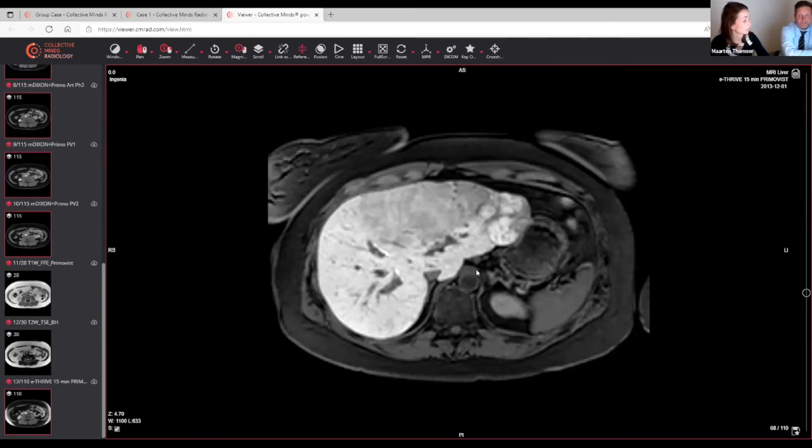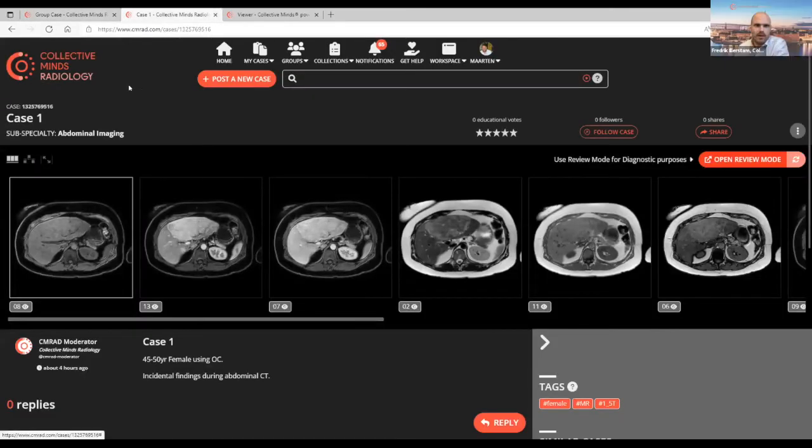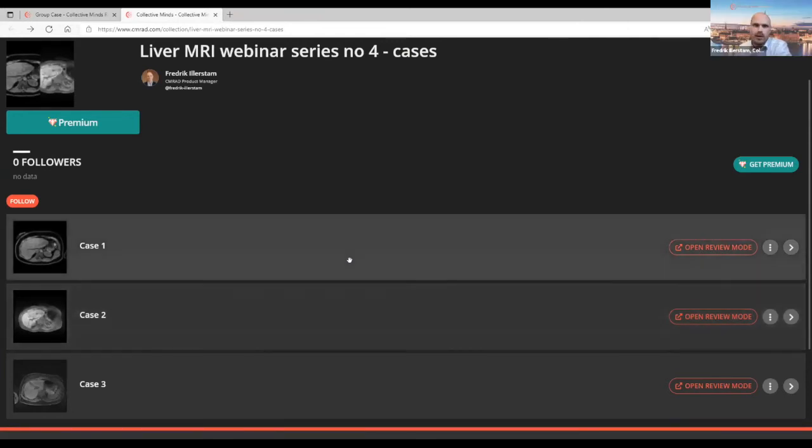Okay, that's interesting. So this was the first case. Then we go to the next one. We did have some questions in the chat meanwhile. Yes. So the first question was how to differentiate between the atoll sign and targetoid cholangiocarcinoma.